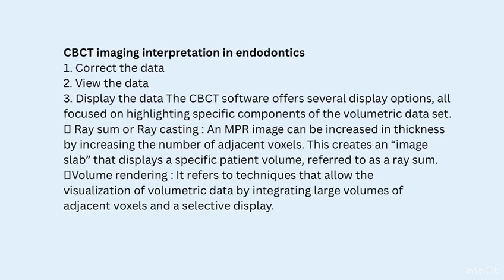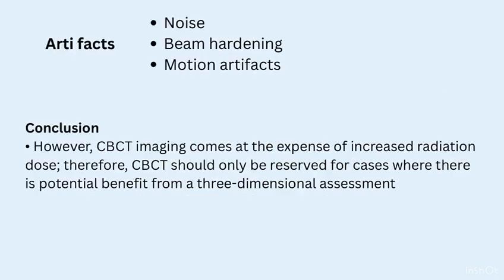and a selective display. The artifacts associated with CBCT in endodontics are noise, which is defined as a result of inconsistent attenuation values in projection images derived from rounding and photon counting errors. Scattering, caused by photons deviating from their original path after interaction with matter, resulting in an increase in measured intensities.